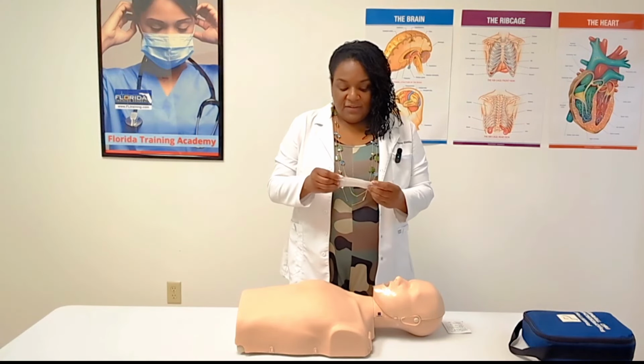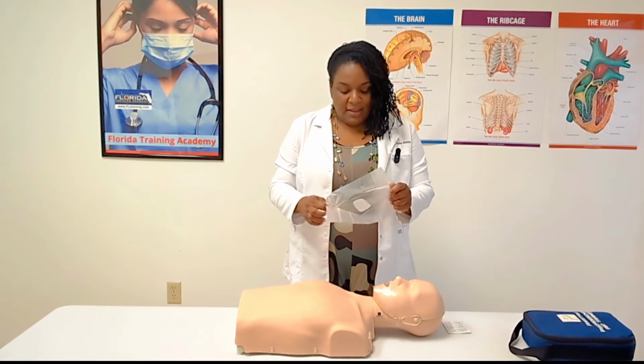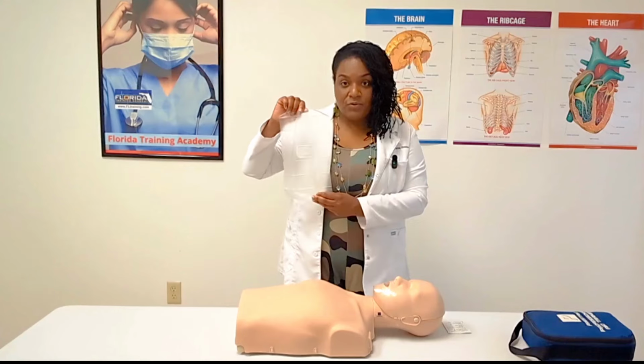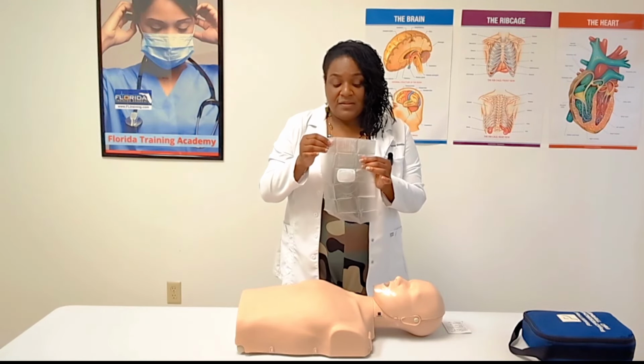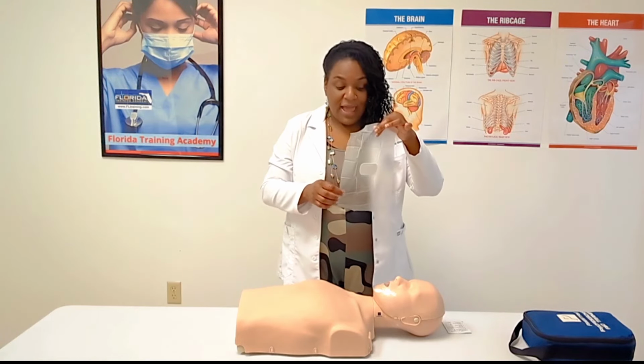When you're using the face shields, I want you to know that they are designed to prevent vomit from crossing. They're designed to prevent you from contracting herpes, but this filter isn't strong enough to prevent COVID from passing.